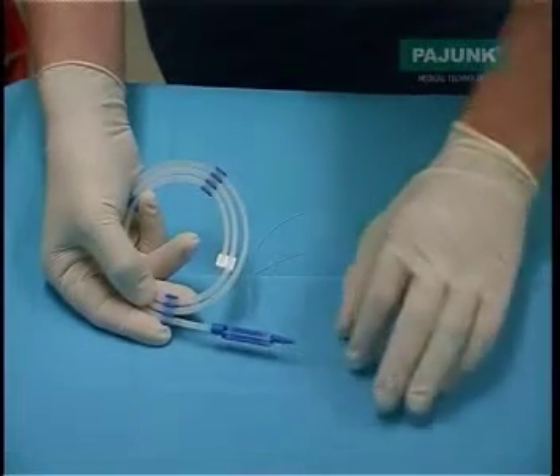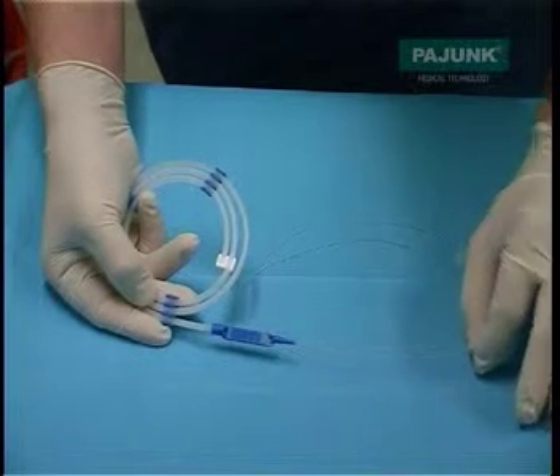The catheter contains a guide wire and this is automatically withdrawn by pulling away on the cassette.